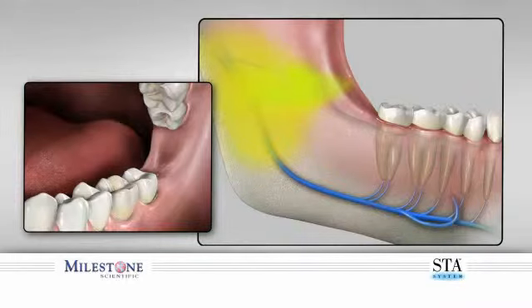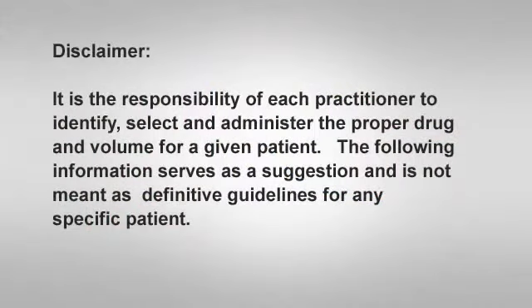Should you require more than 1 anesthetic cartridge, you can reload subsequent cartridges and continue as required. Please see the section on multi-cartridge technique. It is the sole responsibility of each practitioner to identify, select, and administer the proper drug and volume for a given patient. The following information serves as a suggestion and not meant as definitive guidelines for any specific patient.